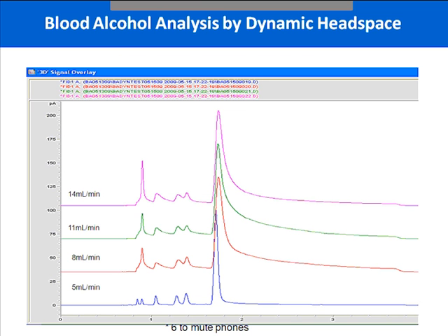Switching back to the dynamic headspace mode, this slide exhibits the effects of changing the sweep flow rate while maintaining the other parameters. The sweep flow rate was changed from 5 mL per minute to 8, 11, and 14 mL per minute. The best sweep flow rate for the dynamic headspace method was determined to be 5 mL per minute. As you can see, the others started overloading the system with too much sample.